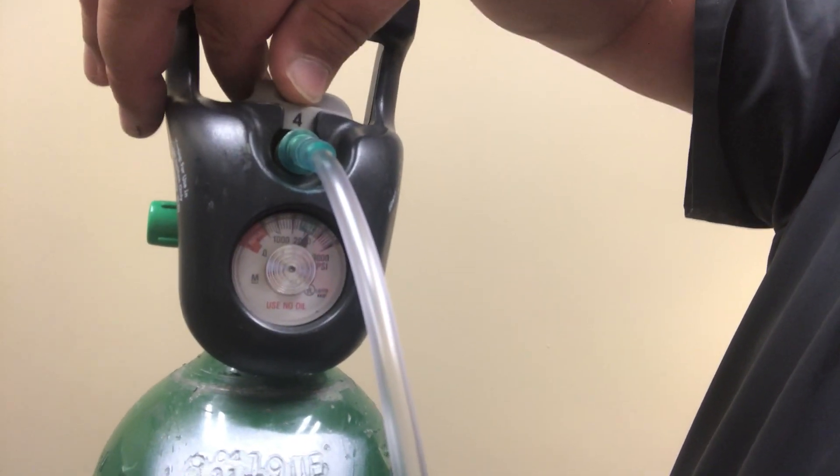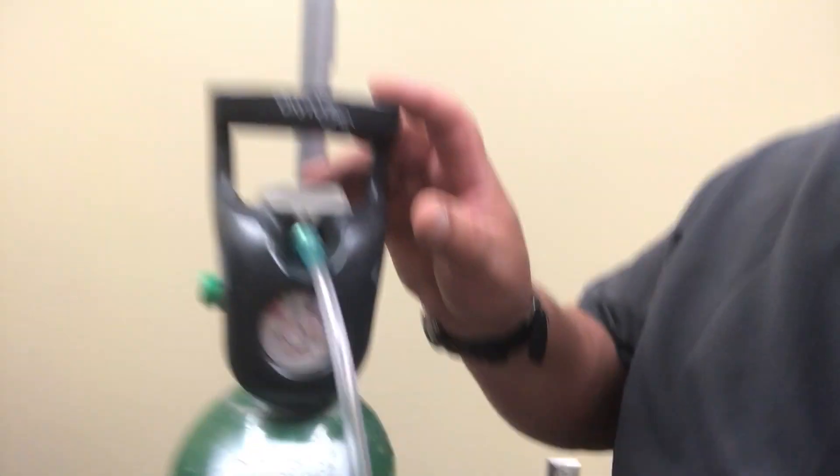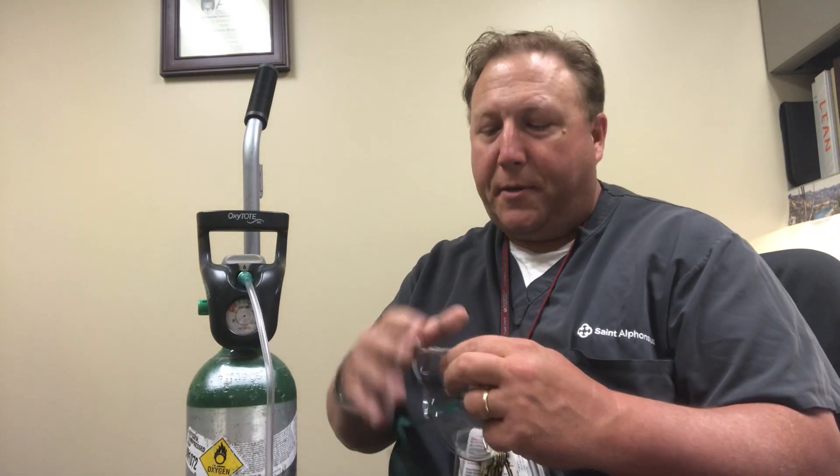I can also hear it when I turn this valve. This shows six liters per minute and that's what's reaching the patient. The flow of oxygen should be going through the mask before it's placed on the patient.